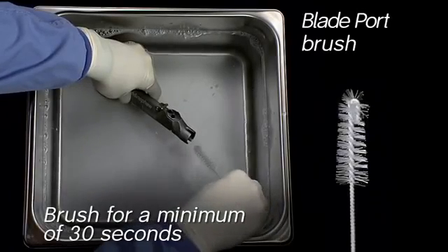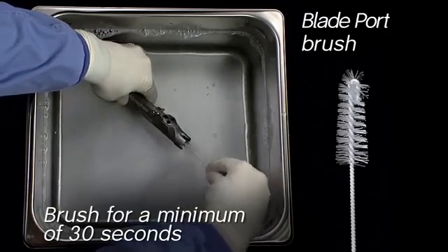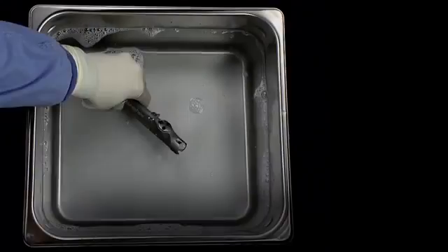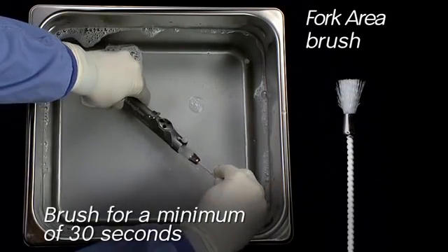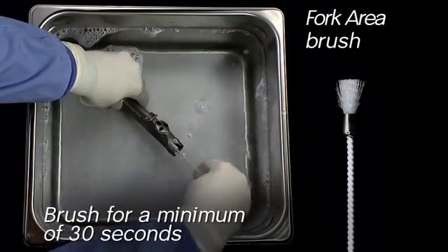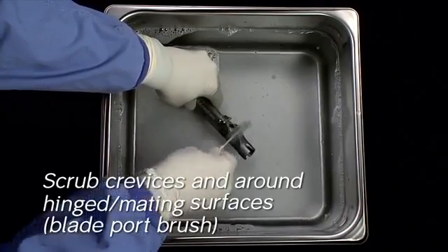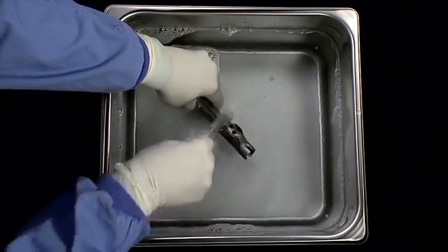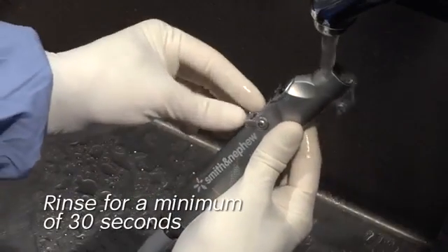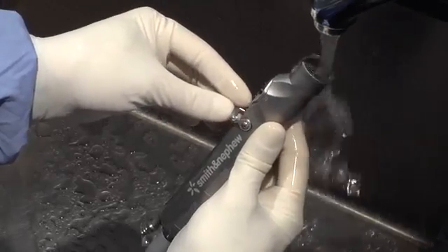Using the blade port brush, clean the nose cavity using twisting and in-and-out movements for a minimum of 30 seconds. Using the fork area brush, clean the dry fork area for a minimum of 30 seconds. Scrub crevices and around hinged and mating surfaces with the blade port brush. Rinse thoroughly with warm tap water for a minimum of 30 seconds, making sure to irrigate all features of the device.